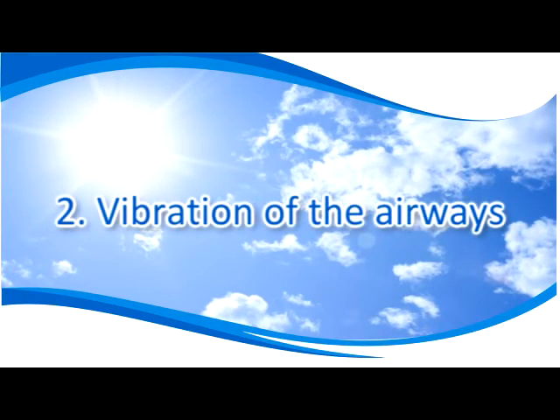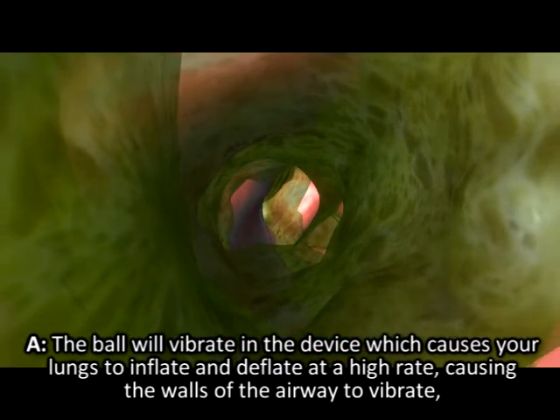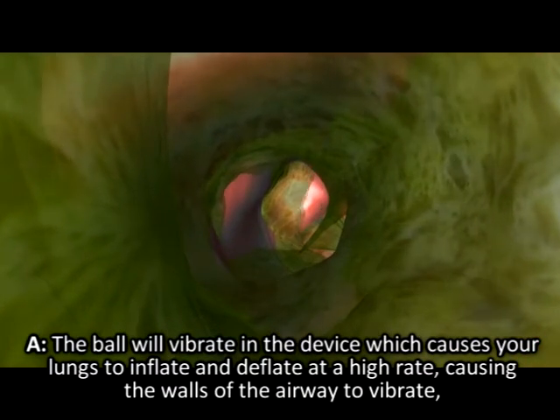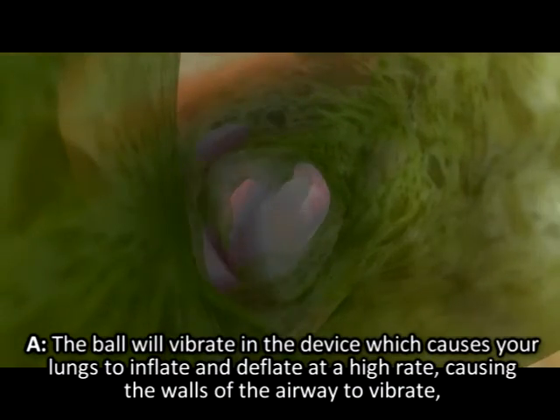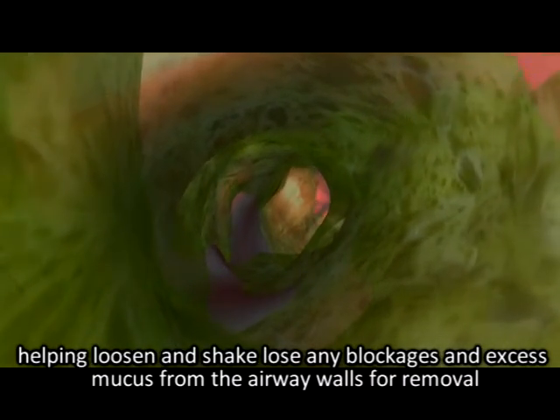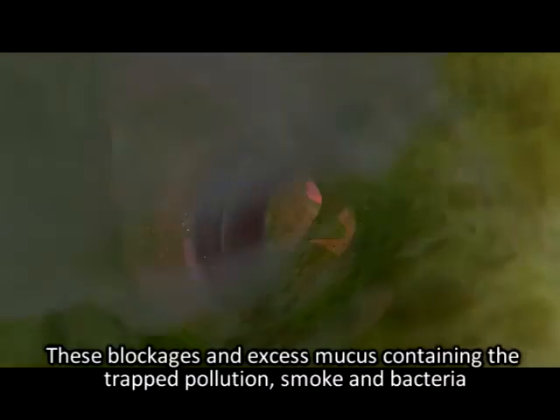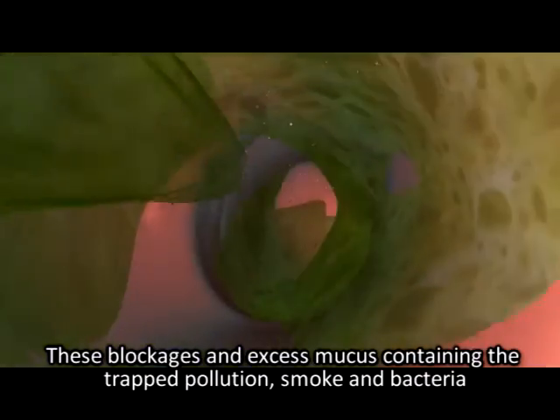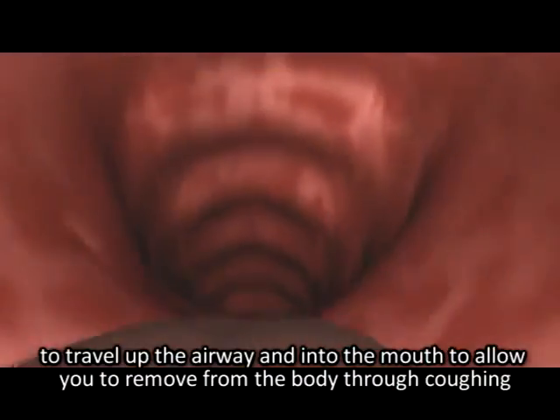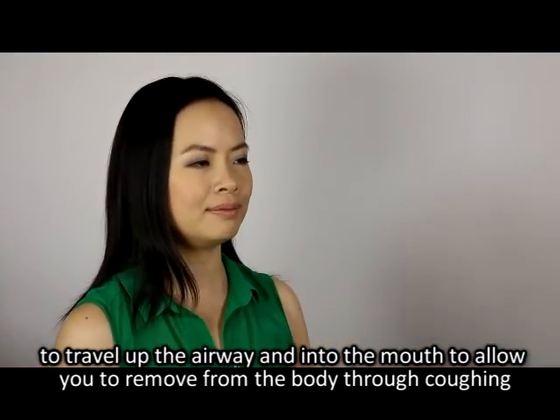And allows for loose mucus on the walls to loosen and enter the airways for removal. Two: vibration of the airways — the ball will vibrate in the device, which causes your lungs to inflate and deflate at a high rate, causing the walls of the airway to vibrate, helping loosen and shake loose any blockages and excess mucus from the airway walls for removal. These blockages and excess mucus containing the trapped pollution, smoke, and bacteria travel up to the airway and into the mouth to allow you to remove them from the body through coughing.